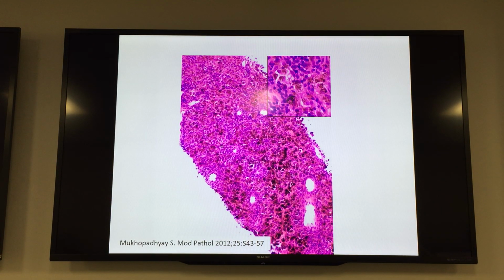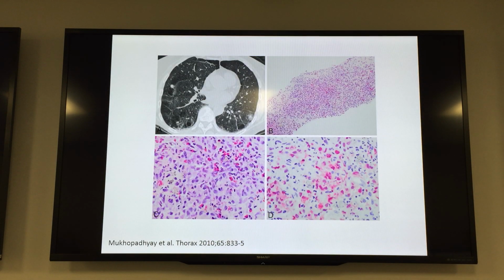You can also biopsy lymph nodes inside the lung that look like nodules. So, benign intrapulmonary lymph node. And finally, you see this patient has multiple bilateral lung nodules. Do you see that on the CT? Small bilateral nodules. Clinicians are usually worried about fungal infection or disseminated malignancy, TB. But what do you have on the back?